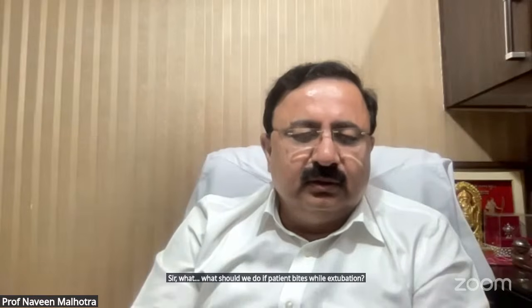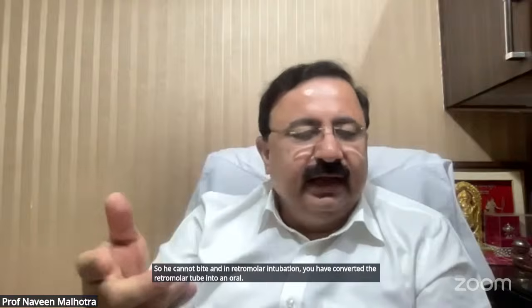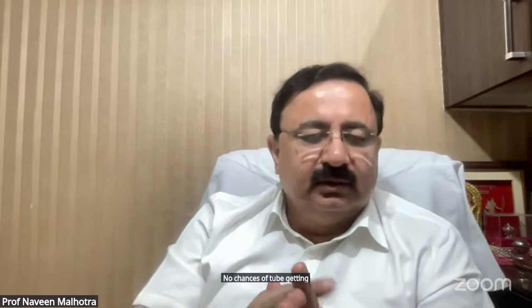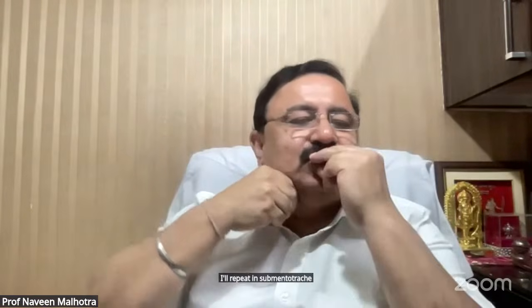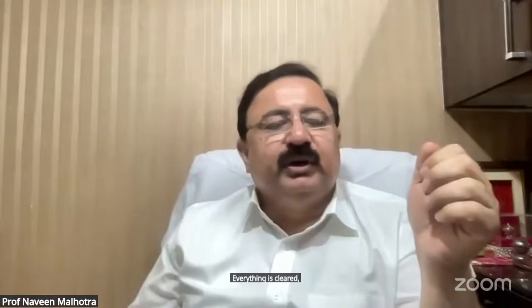What should we do if patient bites while extubation? What will he bite? In the submental region, the tube is lying here, so he cannot bite. And in retromolar intubation, you have converted the retromolar tube into an oral one and then given reversal and then extubated. So there are absolutely no chances of the patient biting the tube. I'll repeat, in submentotracheal intubation, you are going to pull it like this. Mouth is open, do suctioning, laryngoscopy, everything is cleared, remove the tube from here. In retromolar, you remove the wire, convert it into oral, then give reversal and then extubate.